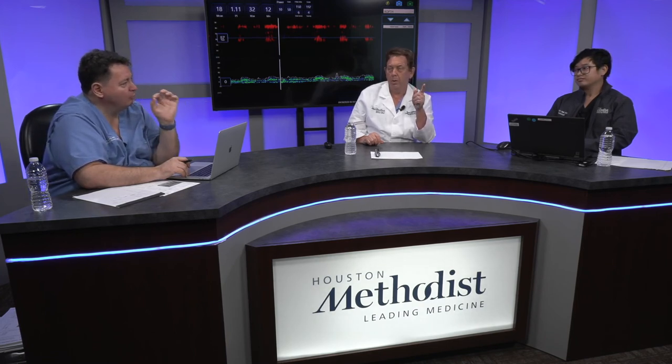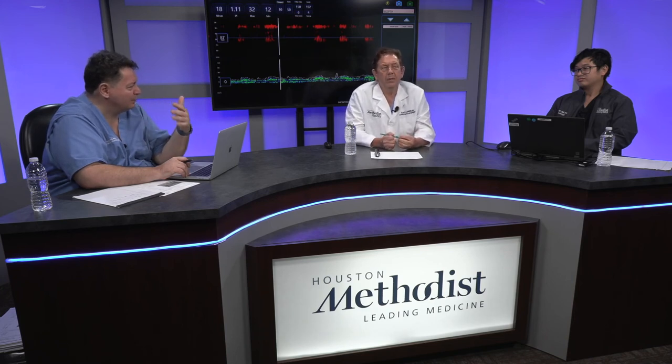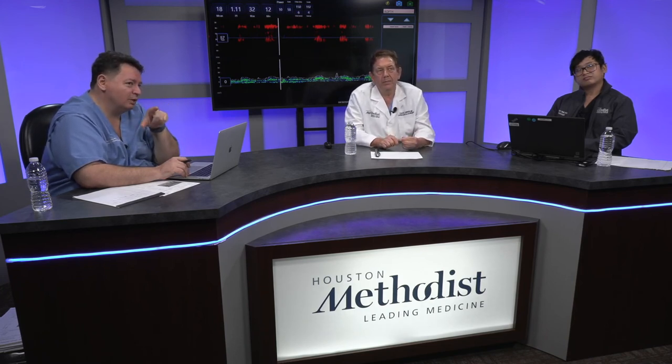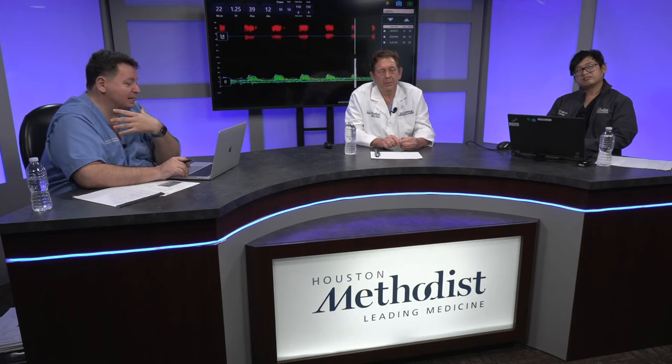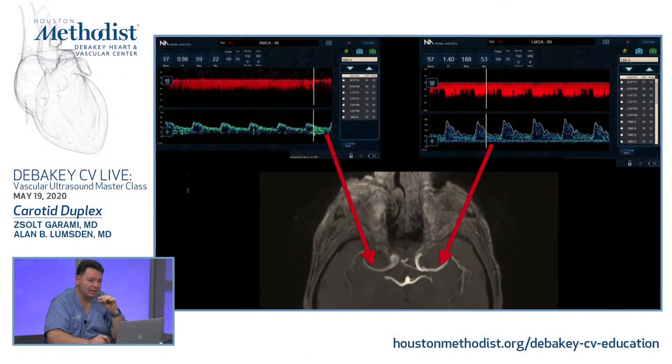First, you want to confirm that your carotid is open, because having an 80% stenosis doesn't mean it's really reaching your brain. The low diastolic flow pattern told me that yes, you have antegrade flow in the ophthalmic, and hopefully your MCA is going to tell you too. This is what you wanted to show. On the bottom you see an MRA as a reference. My two MCAs, the right side is on the left side of the screen and the left side is on the right, but you can see the differences. Your systolic upstroke is delayed on the right side, and the velocity on the left is increased. That's another criterion we will talk about when we talk about TCD.